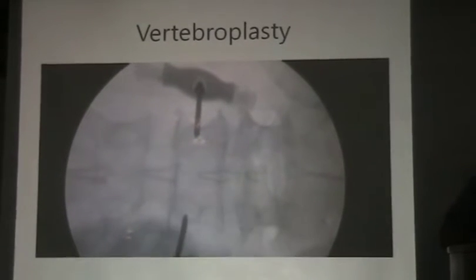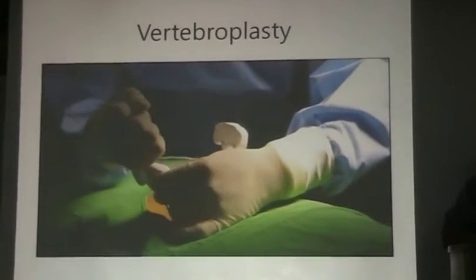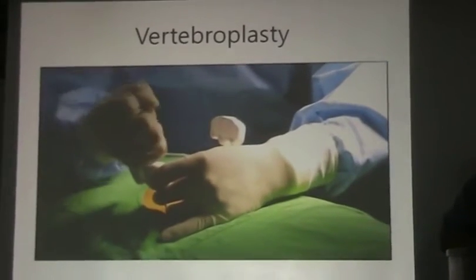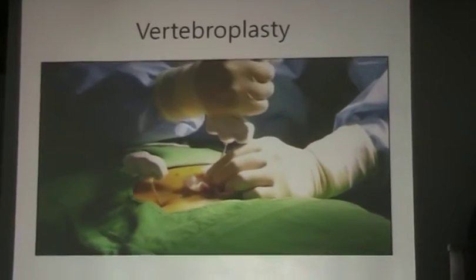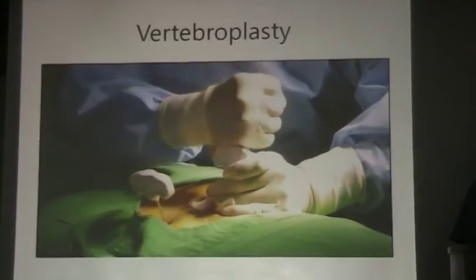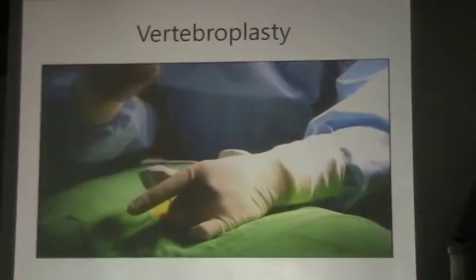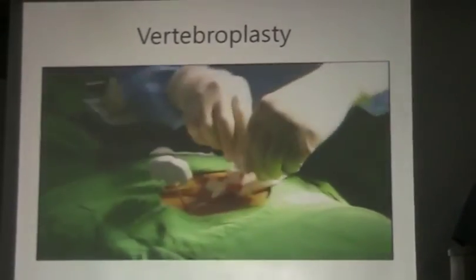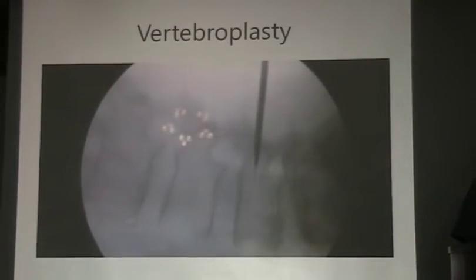If you can do vertebroplasty, you can do the percutaneous pedicle screw fixation also. Just under the local anesthesia.